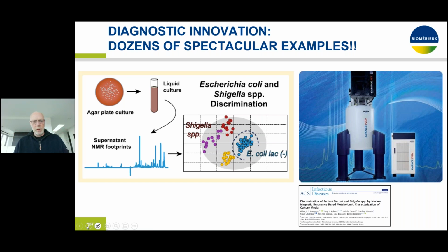But the only thing I want to specifically state here is that mass spec is in the lab, it's well accepted, it's been embraced by the microbiological and the clinical community, but there are parallel developments there that you need to continue looking at. And the two most important ones there, and I'm not going to detail that very much today, there may be another occasion for that, but you are all aware of the fact that PCR technology or other nucleic acid amplification technologies can be used for detection and identification of bugs from clinical specimens.